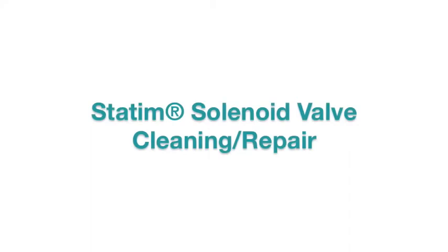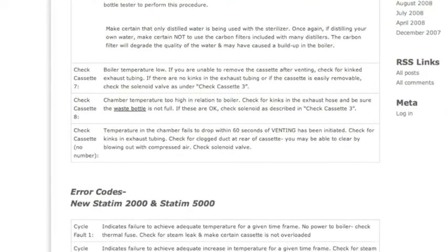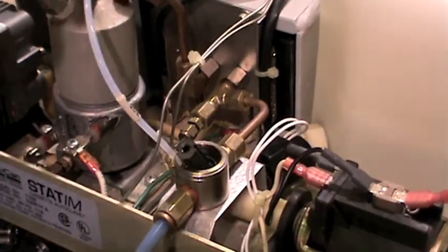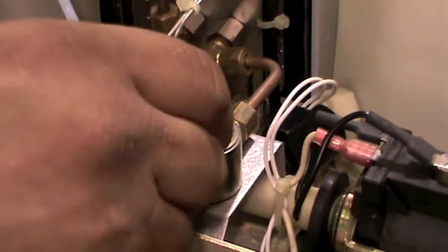A problem with a solenoid valve may be indicated by several cycle faults or error codes — everything from failing to pressurize and reach an optimum temperature, to difficulty removing a cassette after venting. A loud buzzing noise indicates a clogged solenoid. Many of these errors suggest cleaning the valve of debris or checking for ease of movement of the plunger in the plunger tube.